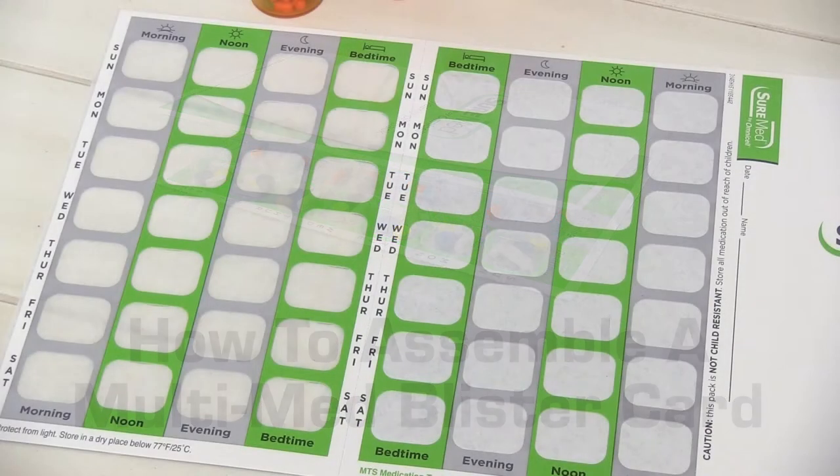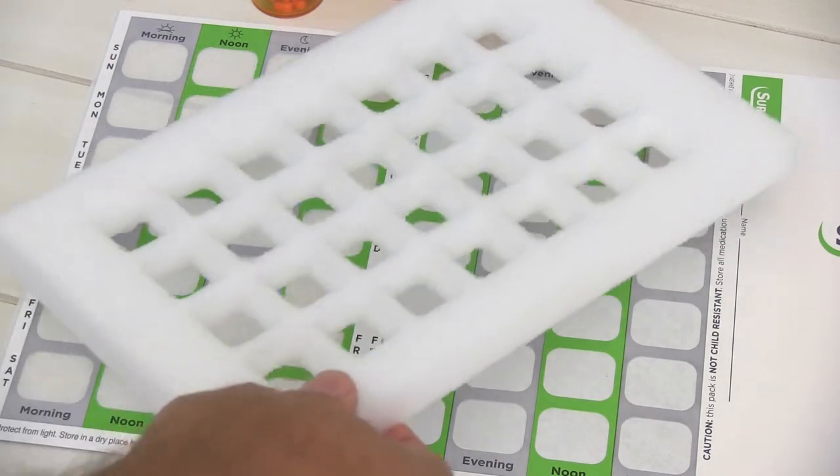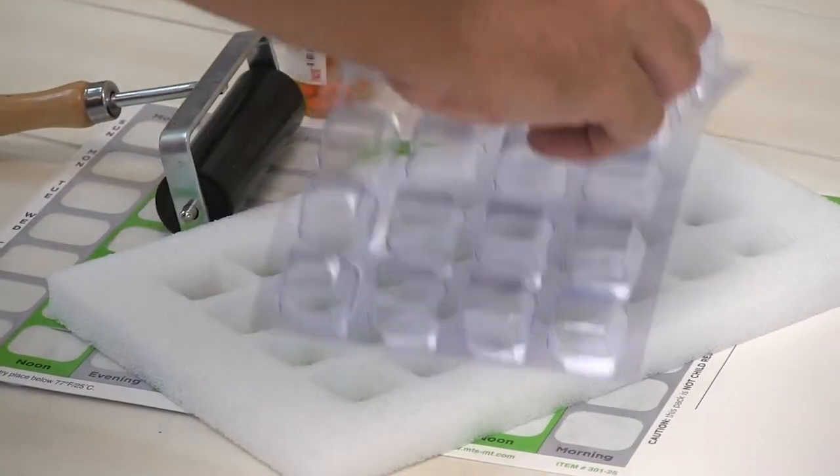To assemble your Multimed card, you'll need a card, a filling template, a roller, and a blister.